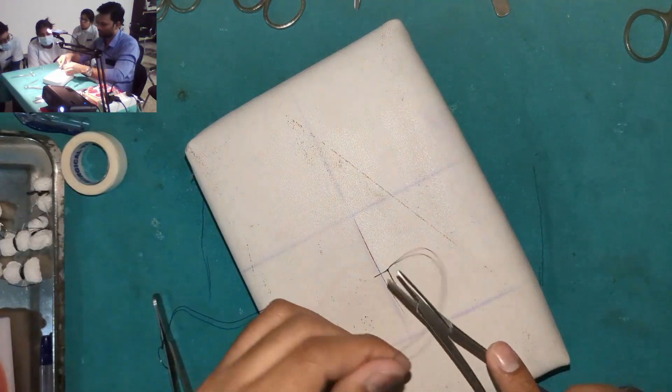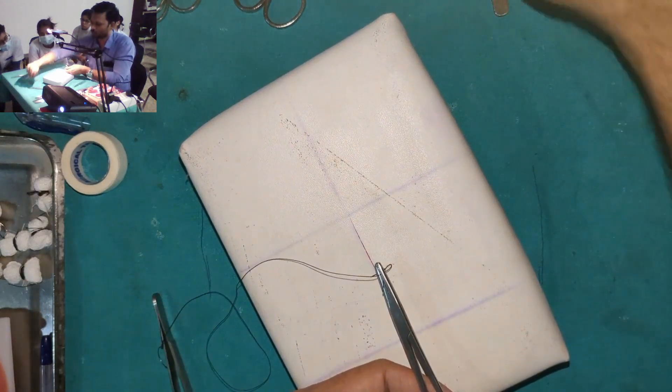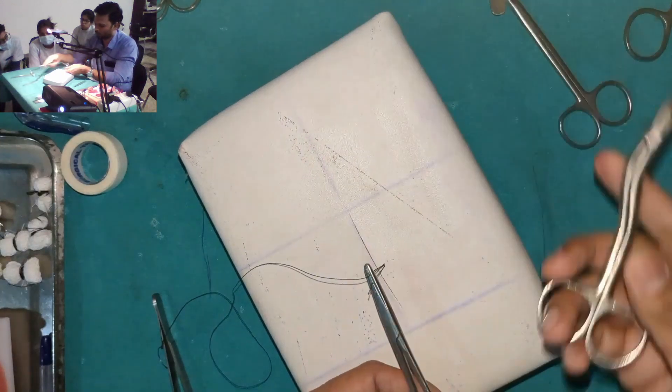Now when we cut the suture, I told you the magic number is 4 mm, right? So when you are going to cut the suture, I told you this is a suture cutting scissor.